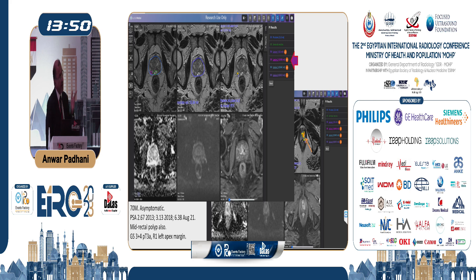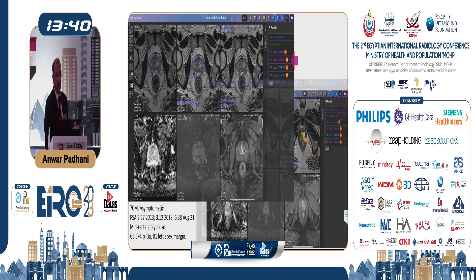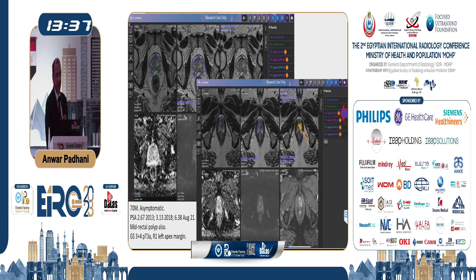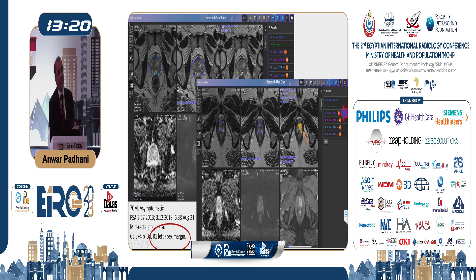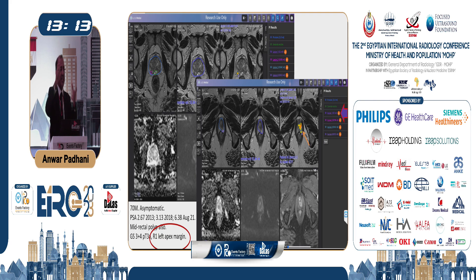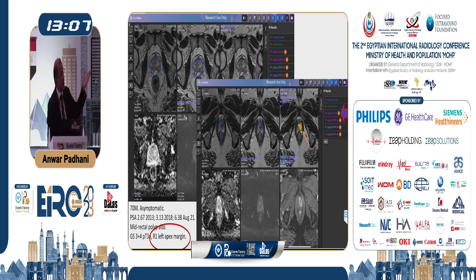If you use an AI, you can see it identifies the lesion at the right base clearly, but it also identifies the lesion at the apex on the left — which the radiologist missed. As a result, this patient had an incomplete resection at the left prostatic apex, an R1 resection, and needed post-operative salvage therapy. The AI could have assisted the radiologist in identifying the right lesions.